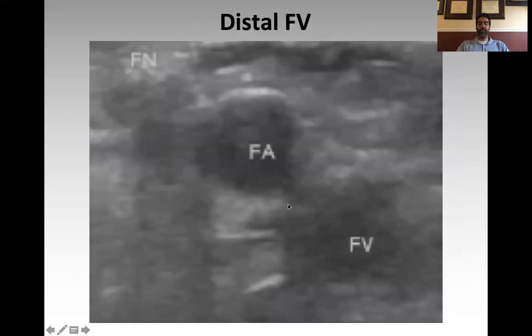And you continue to follow the femoral vein as you go. This slide shows you that as you go more distal, the femoral vein is going to get deeper and deeper in your field of view. So what you want to do is continue to increase your depth so that you keep the femoral vein in the center of the screen, unlike what's shown here. So increase your depth to keep this centered up and down, and make sure that you are centered left and right. Because again, when you compress down on the vein, you want to make sure all that force is being exerted axially right down into that vein. And when you center it up and down, your resolution is going to be the highest.